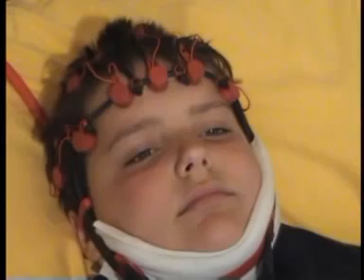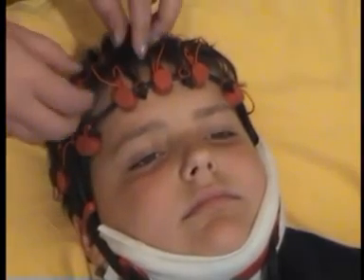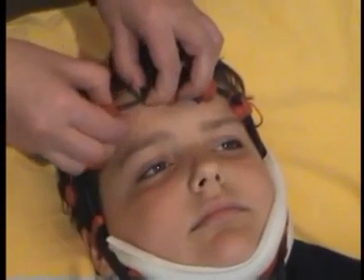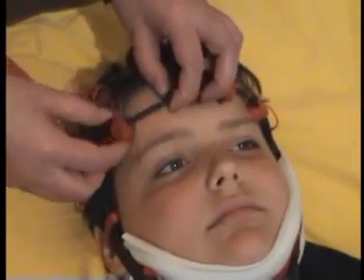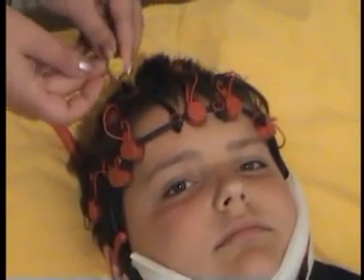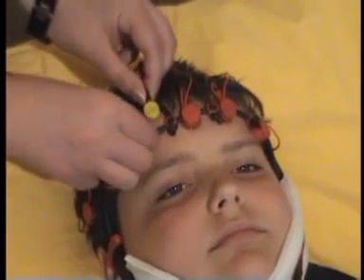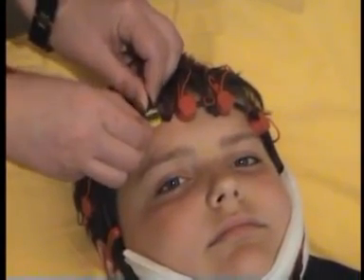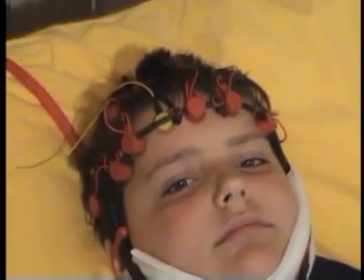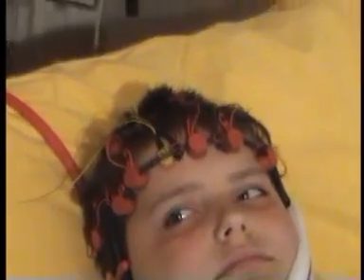Now you will see how to use the bypass electrode. If an electrode should break, it can be easily replaced. For example, if the FP2 electrode breaks, it can be pushed aside and the replacement electrode put in its place. The replacement electrode is directly connected to the connector on the headbox. Recording can be done this way until an expert repairs the cap.